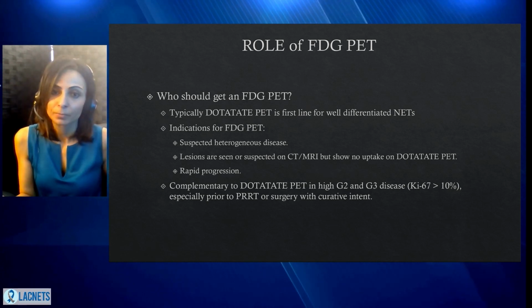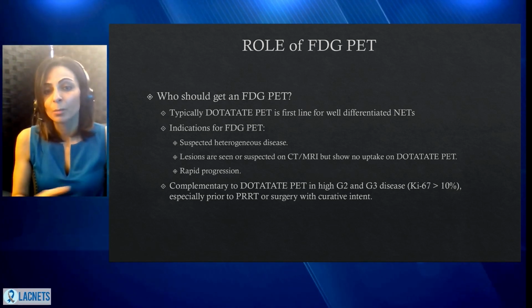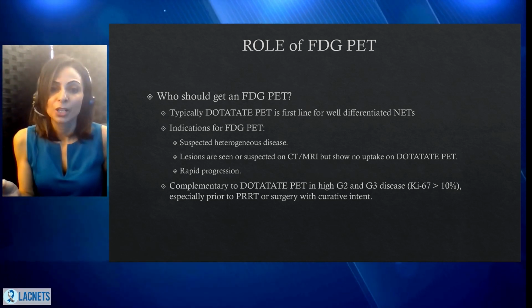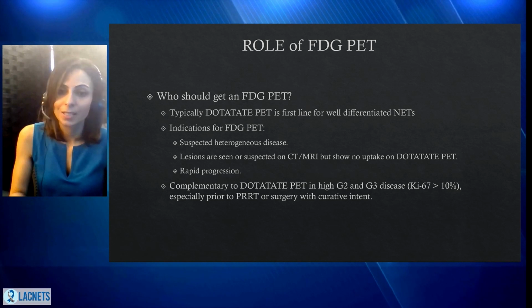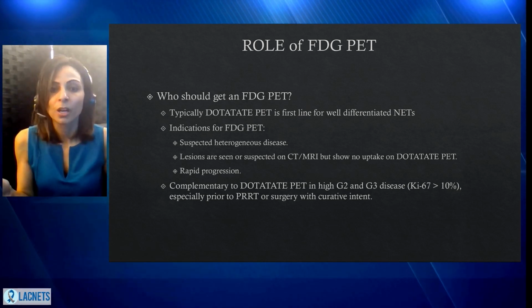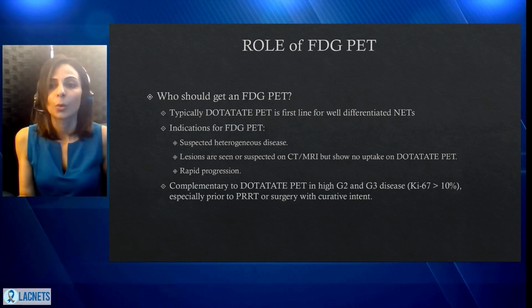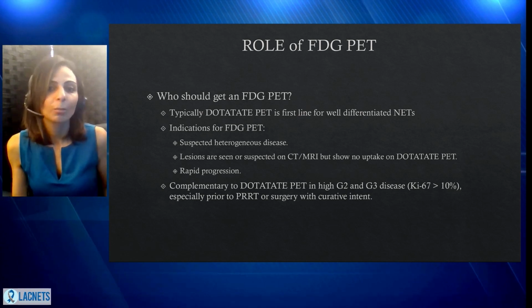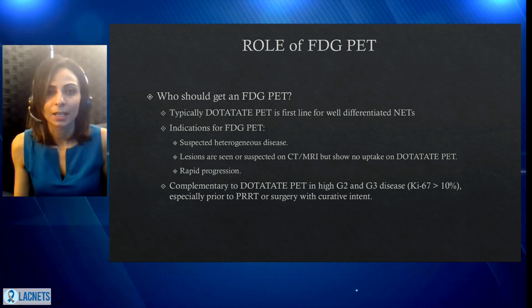Now, FDG could be complementary to dotatate PET, so they could be done simultaneously in patients with high grade 2 and grade 3 disease, especially before PRRT, to better evaluate the tumor, or if surgery is considered with curative intent. So in those cases, FDG PET could be helpful, but not everyone typically gets an FDG PET.